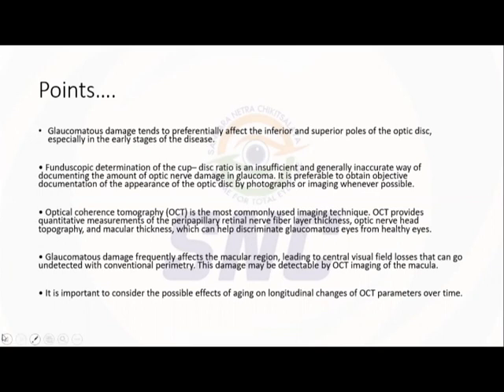So if you are following the dilated fundus examinations, you just look for all these things. Then it will be normal in normal individuals. If at all any finding is suspicious, you just go to the consultant and ask what is this.